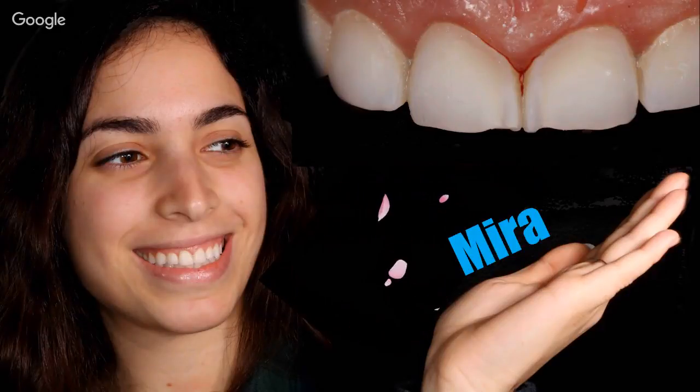But first, I want to show you this clinical case. Mira, the beautiful patient, came seeking an aesthetic treatment, only 2 restorations. She came to the clinic and she had erosion on her anterior teeth, the 2 central incisors.